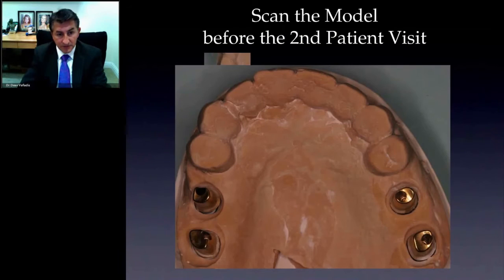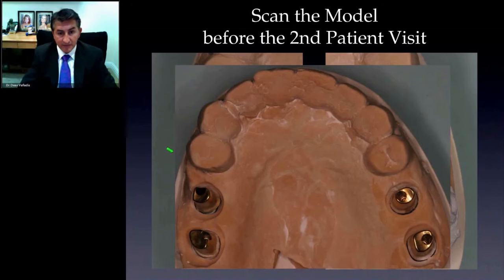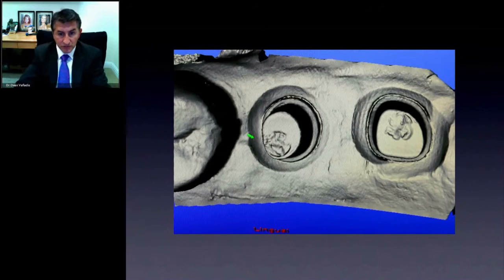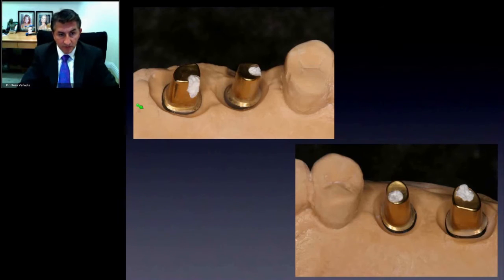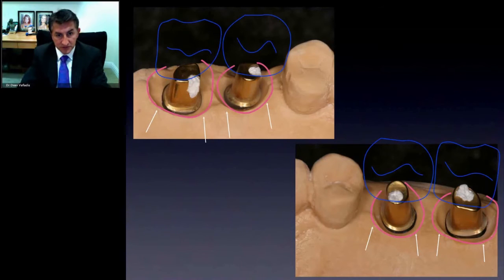In the patient treatment, the laboratory sends us back a final model that we can scan now. If we have a digital scanner, we can take this and scan the final abutments. As you see here, we've opened up the actual model and created this emergence. You see that the line around it is what we've created on the model, and now here's the final abutment margin. We're going to marginate that, and then we're going to create our restoration. This is our first restoration that's created, and then this is our second one. So as you see here, we've created this emergence so we can actually make our provisional fit around that implant and really support that tissue to minimize food impaction. We can envision that the final restorations will look something like this.